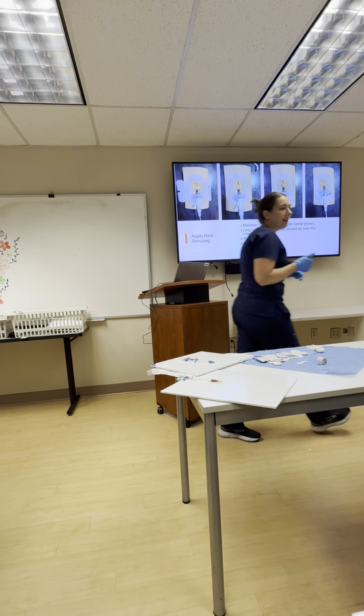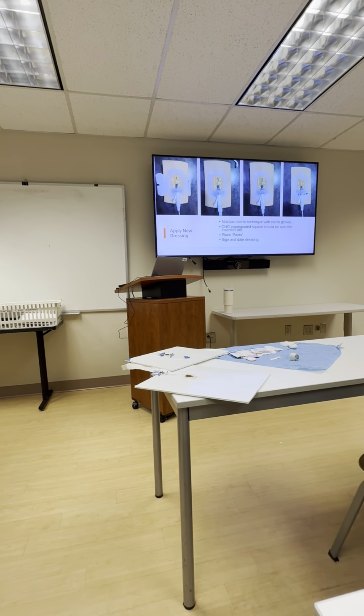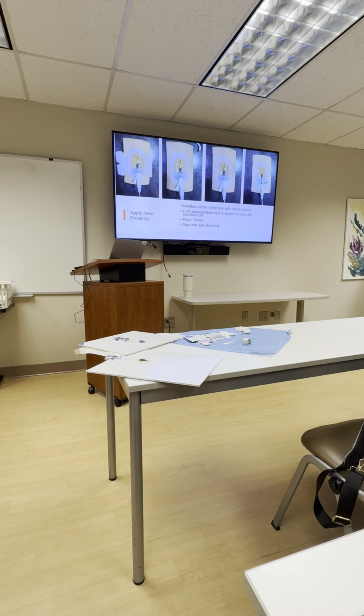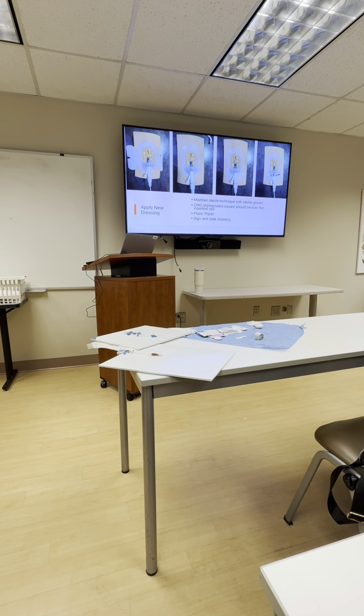Oh, that's the top of it. You want to keep that. So this part. So usually like that. So usually there's another flap, but it's okay. So yeah. No, don't be silly. Sorry, we practice. Yep, over it.